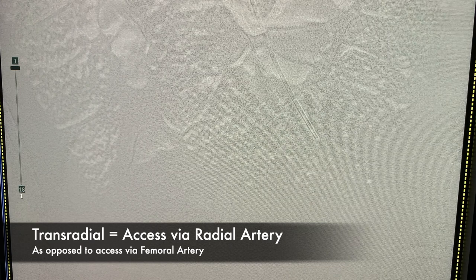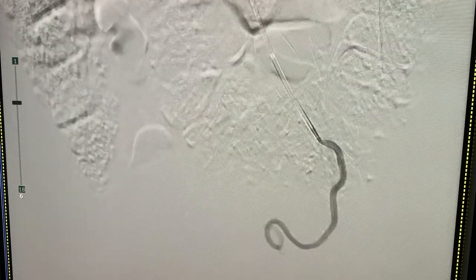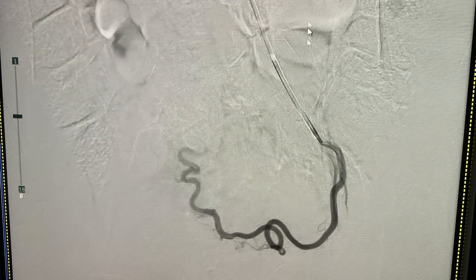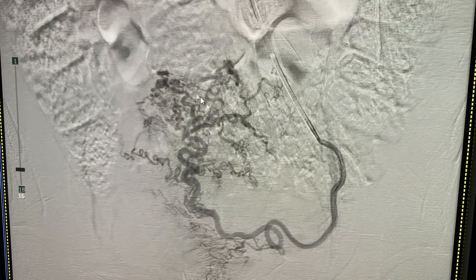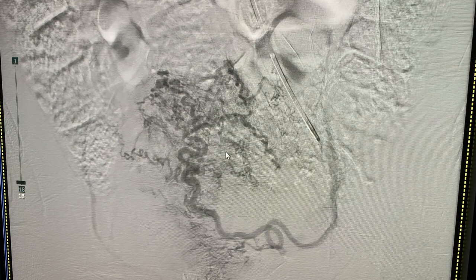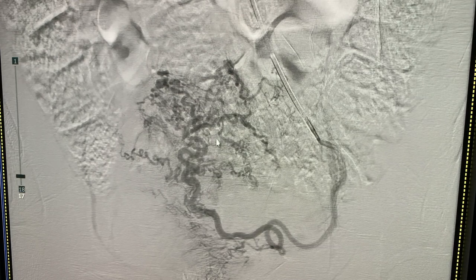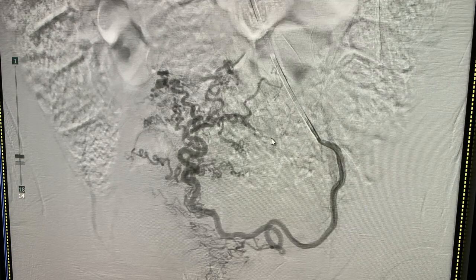Here we're in the left uterine artery, coming from above via a transradial approach using a 5 French Vert catheter. This is a DSA of the left uterine artery. You can see that the artery is very hypertrophied — it has a lot of little hypertrophied branches supplying a large fibroid uterus. Usually these branches are much smaller, and the blush is not as extensive as this.